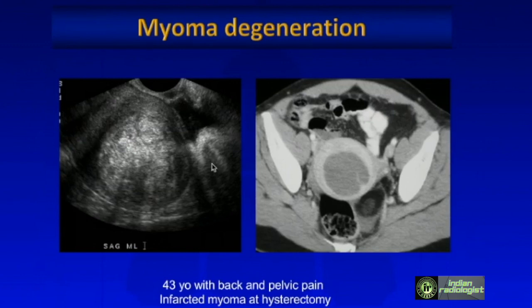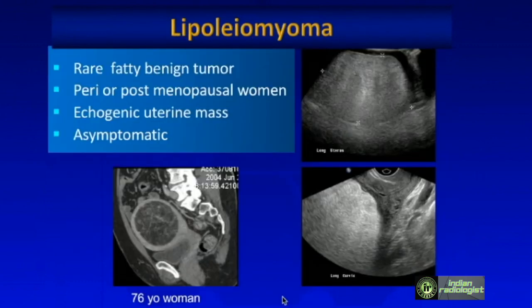This patient presented with back and pelvic pain. She had a CT initially, and you can see this myoma does not enhance normally — probably due to cystic degeneration, which is likely why this patient had pain.